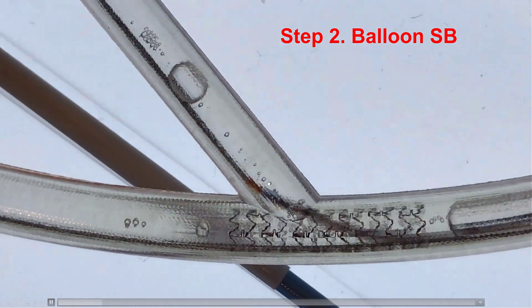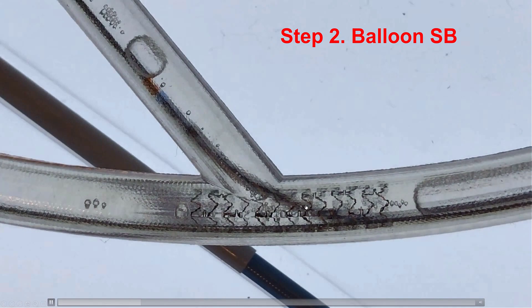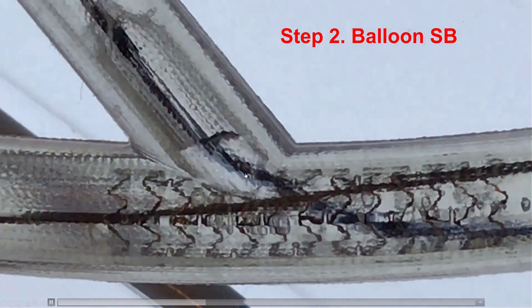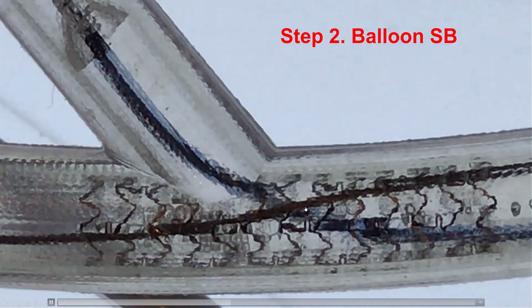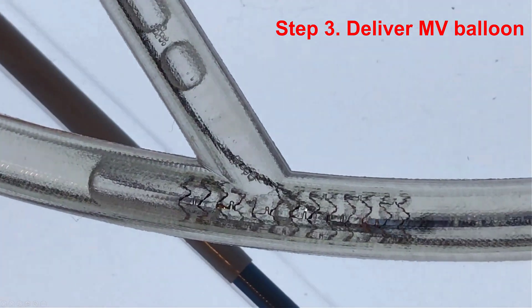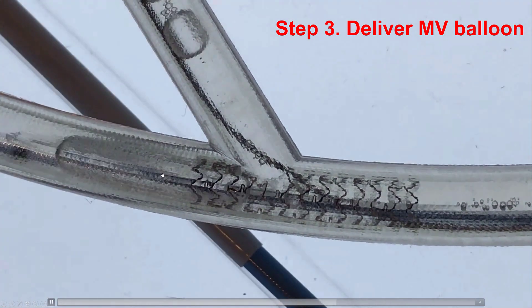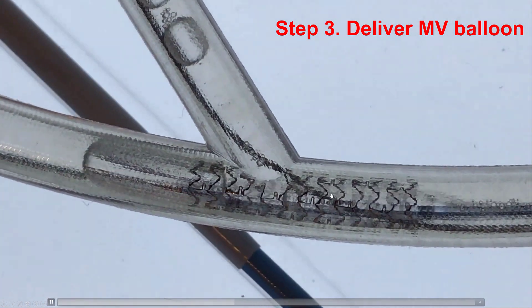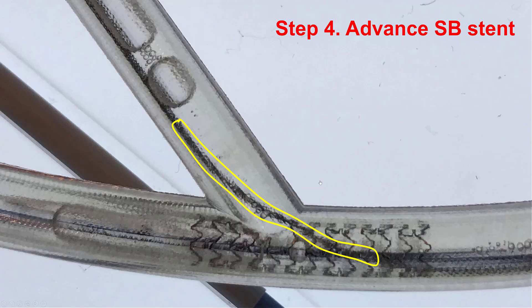Then a balloon is advanced across the side branch over the newly inserted guide wire, and the balloon is inflated to increase the opening into the side branch. Then we deliver a balloon into the main vessel — the role of this balloon is to crush the stent that will be placed subsequently into the side branch. The fourth step is to place the stent into the side branch, partially into the side branch and partially into the main vessel, usually two to three millimeters, but it is okay to have it a little longer.